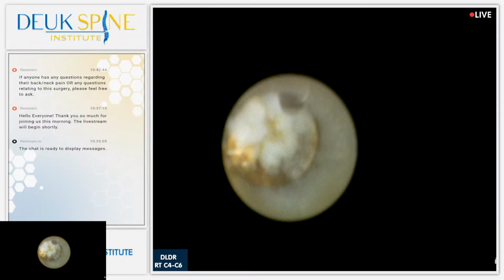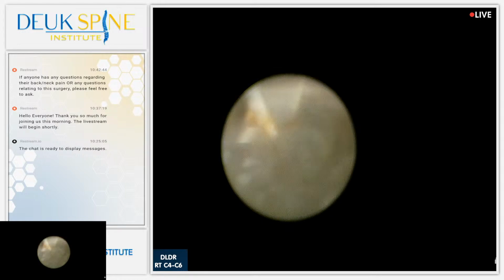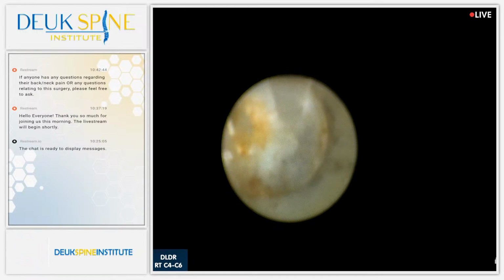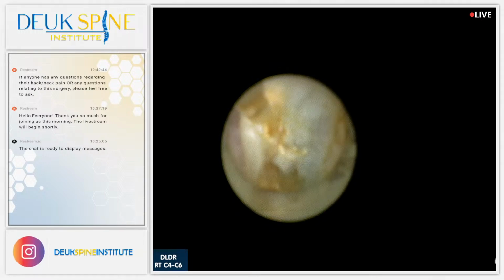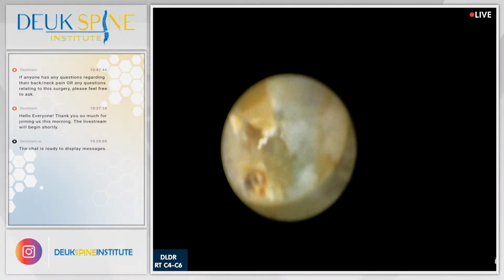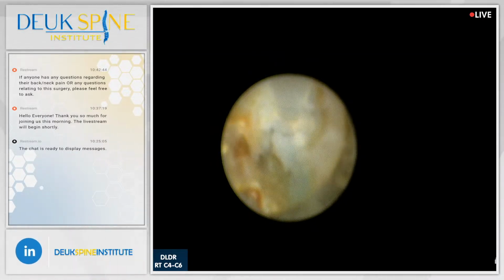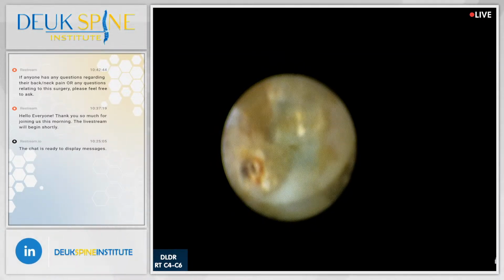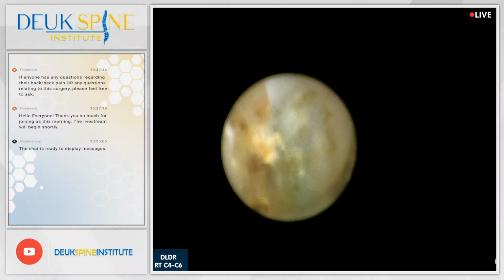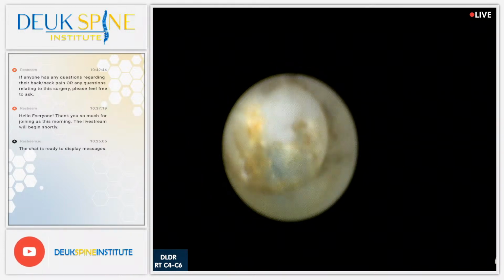Welcome back. You can see from our animation that Henry played for you that what the surgery does, it uses a very small skin incision. We go down to the back of your disc where the herniation actually is, and we remove just the herniation. We don't take anything else out, and because we're not removing the disc like every other surgeon does, you don't need a fusion or metal put in your neck.